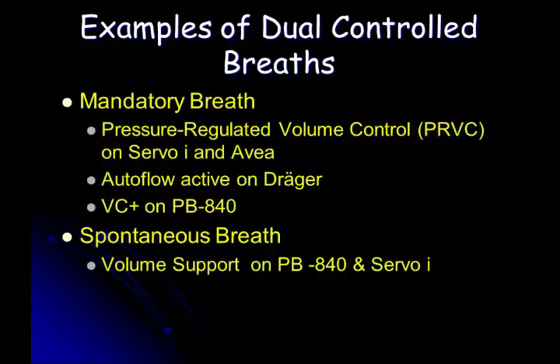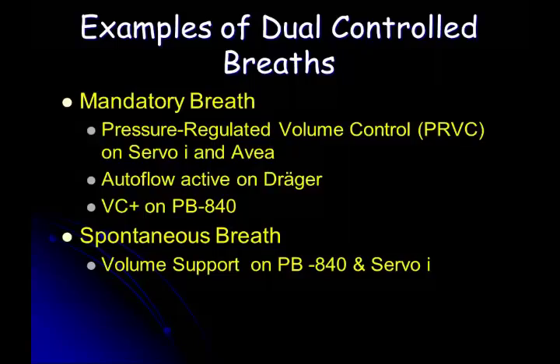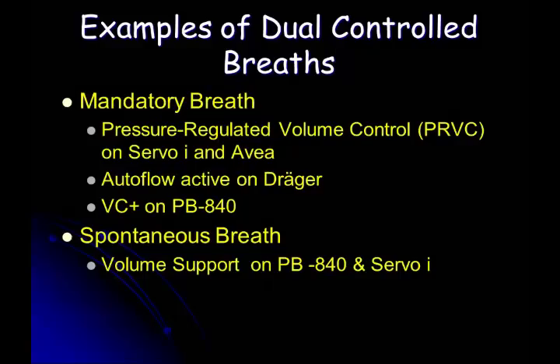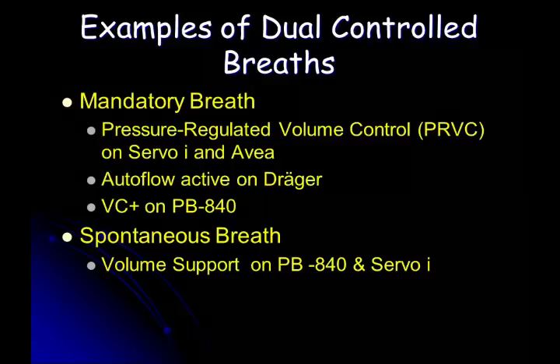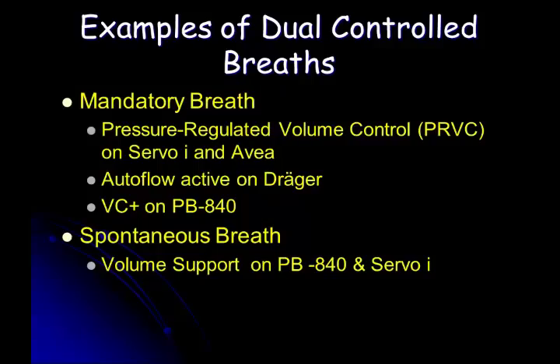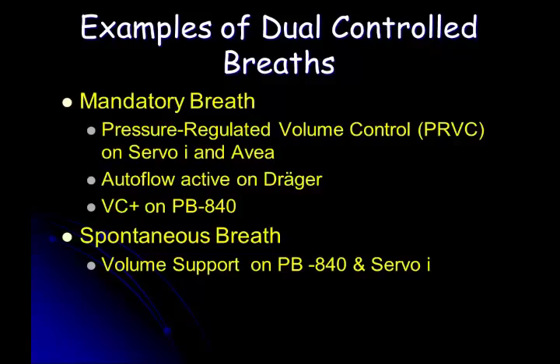So it's a dual mode in the sense that it's looking to see what it did, changing the pressure support level to get to where I want. Those are dual control modes. It's looking at something and changing it. Go ahead. A spontaneous breath then is initiated and ended by the patient, but can be supported with extra pressure if the ventilator determines that it's too low or too high.